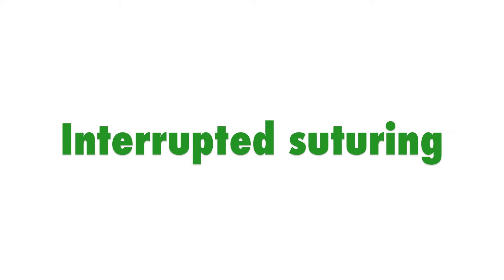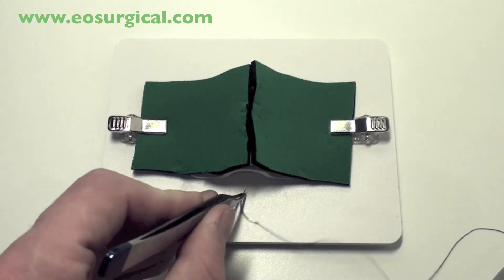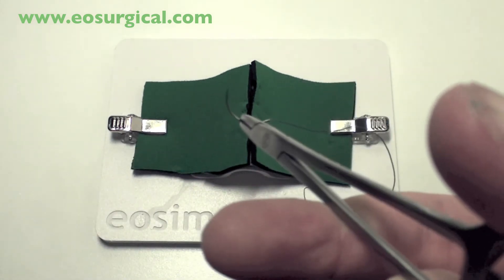One of the key skills you'll have to master as a surgeon is the ability to throw an interrupted suture. The first key skill is actually mounting the needle. Grip the needle roughly two-thirds around the curvature of the needle.